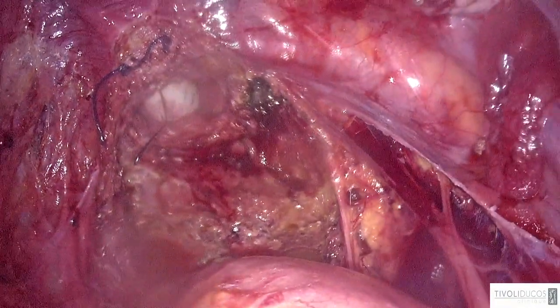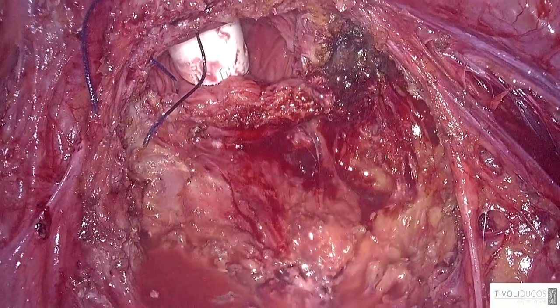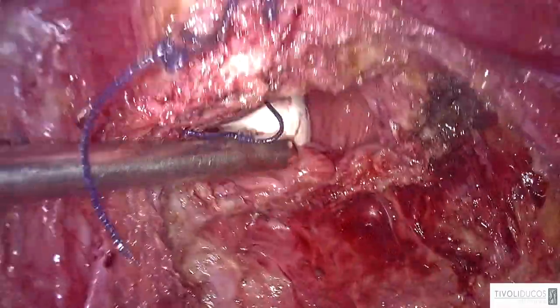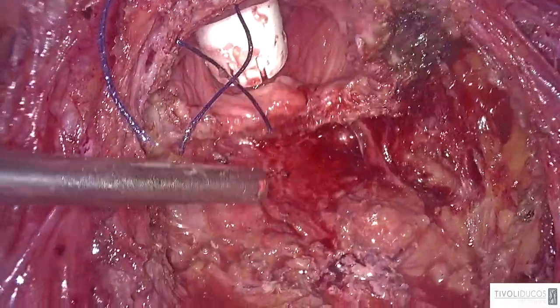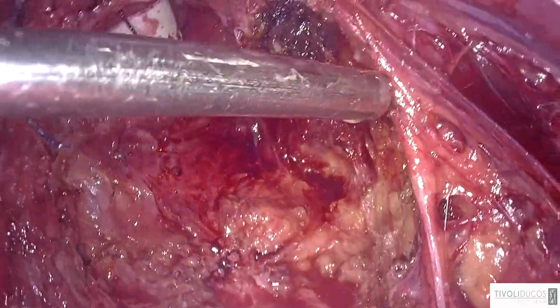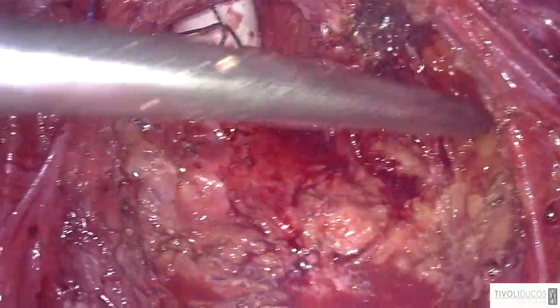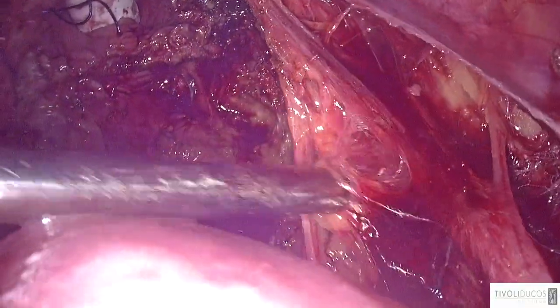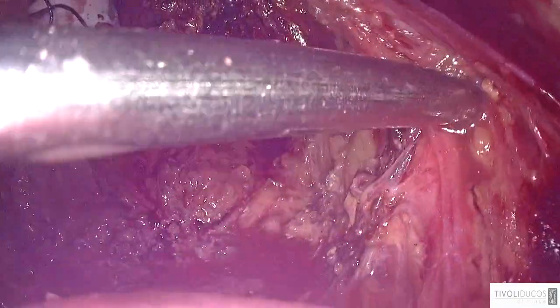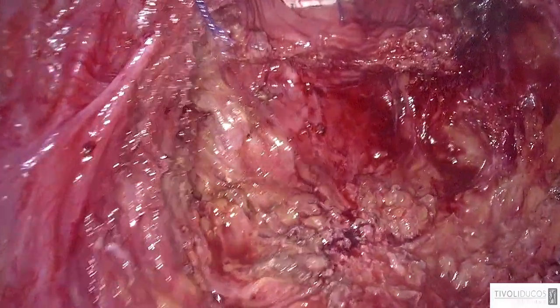Yeah. And when I scheduled this patient, first I suspected the same localization, but then this week when I received the second MRI, I understood that it is less. So I will take care to do a bigger one next year. But this is the most important: it's not the size, but what we have to do to remove it. I think this case is also demonstrative, because it allows us to dissect this parametrium and to preserve the inferior hypogastric plexus, which is here. All these fibers are related to the inferior hypogastric plexus, and we can conserve it completely on the other side. So I think this patient won't have any problem of bladder voiding.